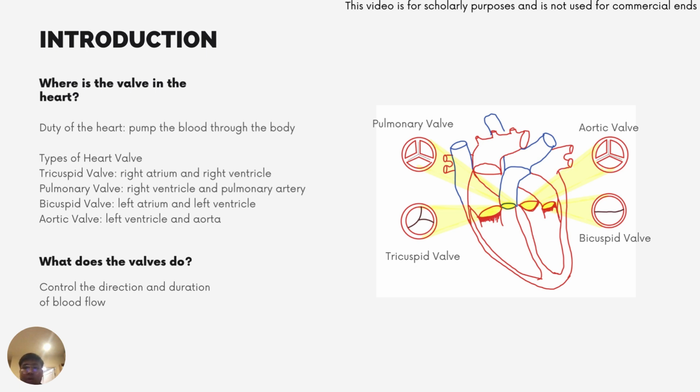And what does the valve do? The main duty of the valve is to control the direction of the blood flow and regulate the duration of the valve opening and closing, which is performed at the same time as the heart beats.